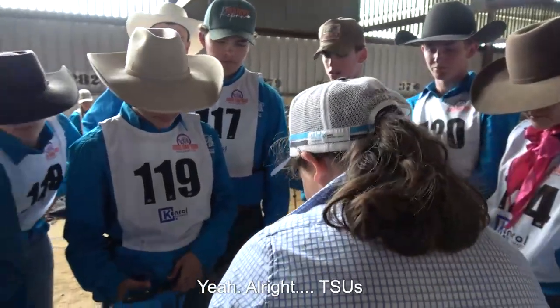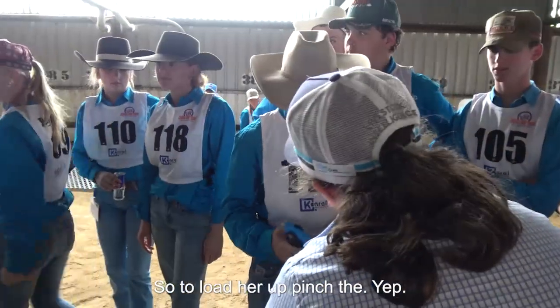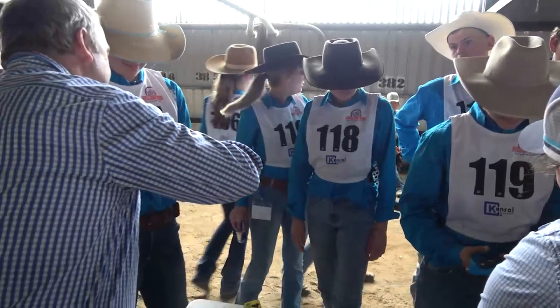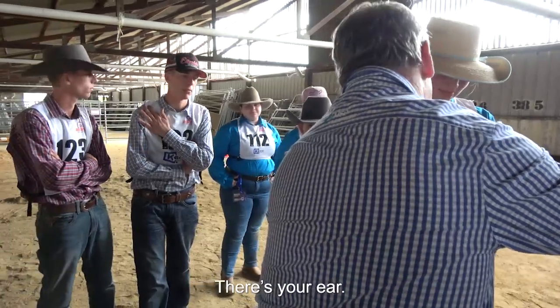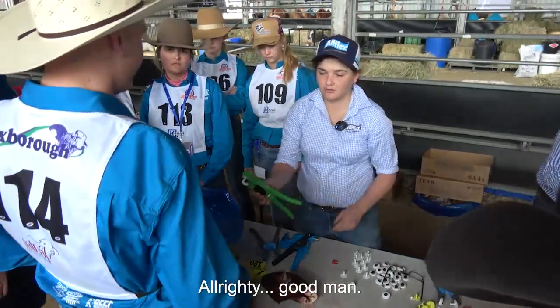All right, TSU. To load it up, pinch that, and that just goes in like that. Squeeze that, let them go. Squeeze together, so it's grabbed. Release, and you just flick that one out. There's your ear. Alrighty. Good man.